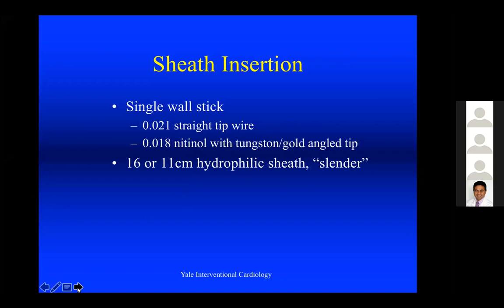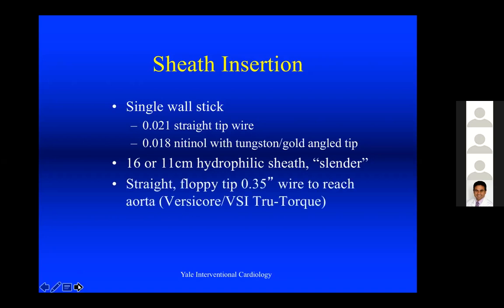We use either a 16 or 11 centimeter hydrophilic sheath. It comes in two kinds of arrangements. The standard sheath is a little thicker. The slender sheaths are thinner, and for the same French size are significantly smaller. And I have a diagram of that upcoming in another slide, and I'll point that out.